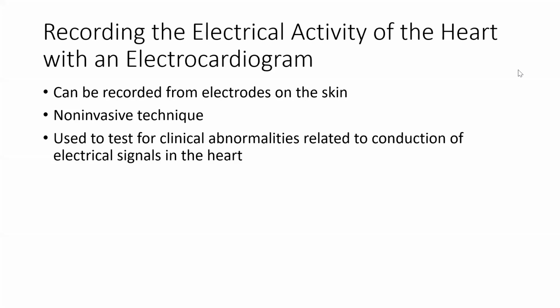which was about the ECG, or the electrocardiogram. So the ECG, sometimes called the EKG, is an electrical activity recording of the heart. We basically place electrodes on the skin. They're placed on the limbs as well as the chest area.